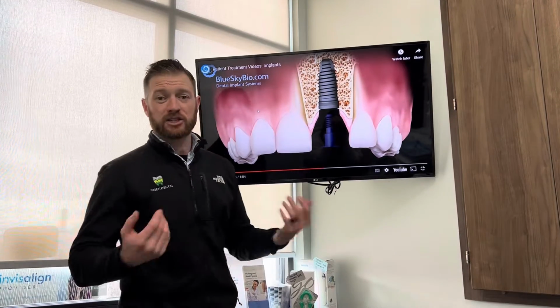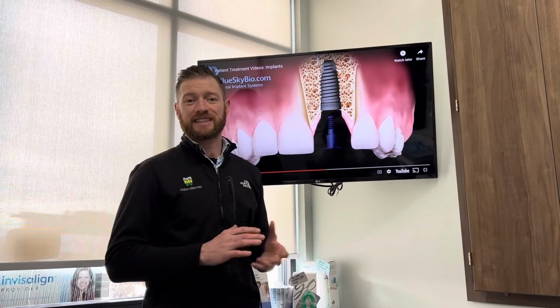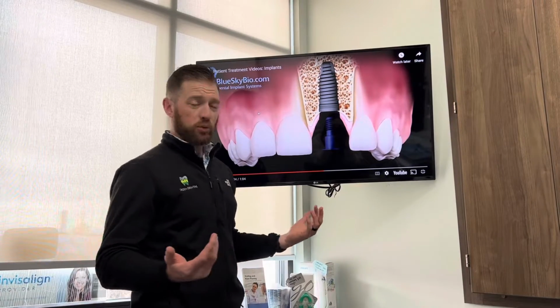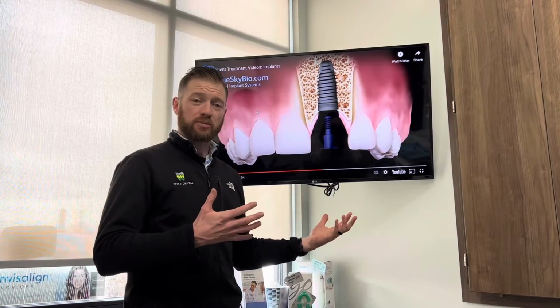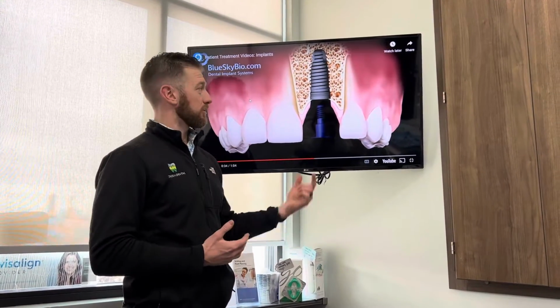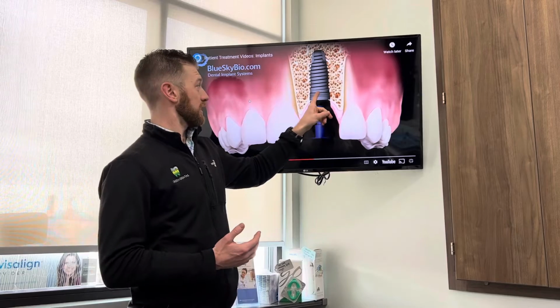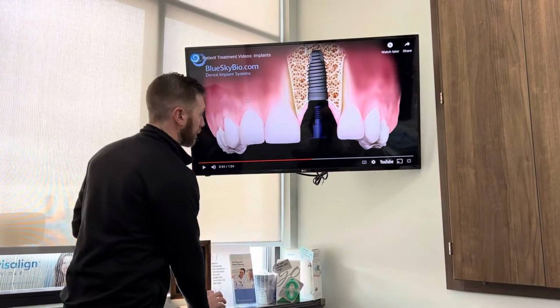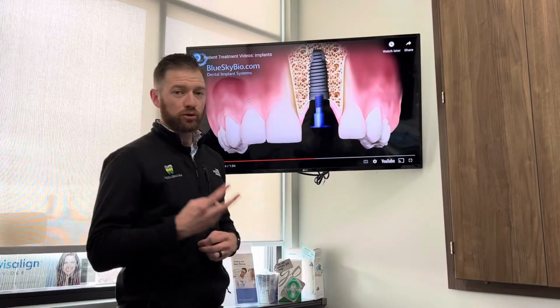There are occasions where we can place the implant at the same time as an extraction. That's not the intent of this video. So appointment 1 is the extraction in this case. Appointment 2 is going to be placement of the implant. So this screw-like material there is the actual implant. And we do a 2-stage process.